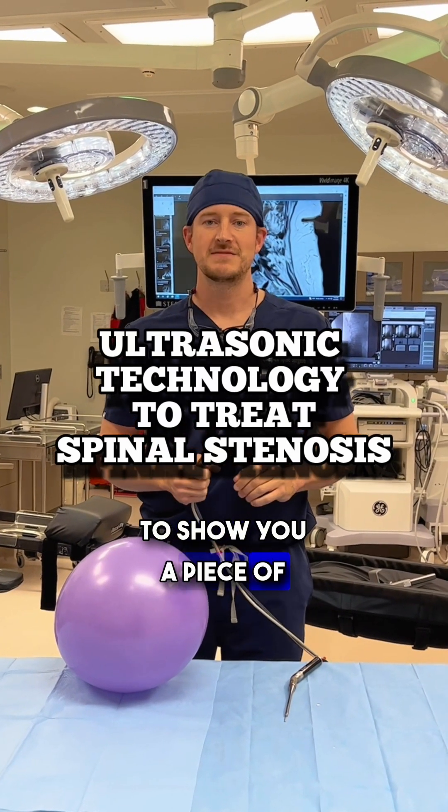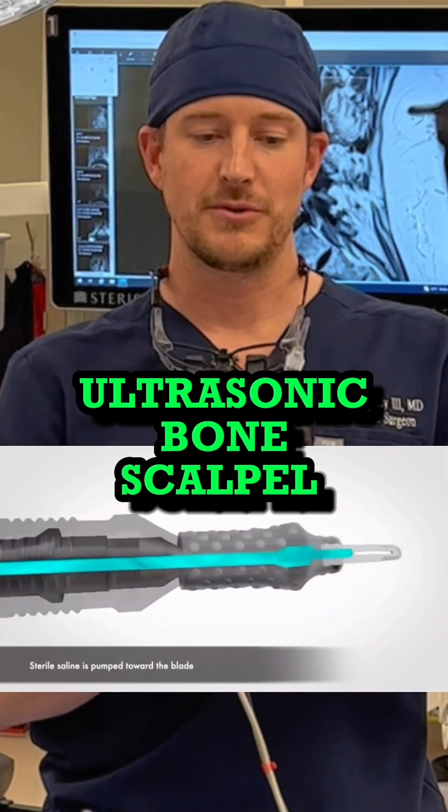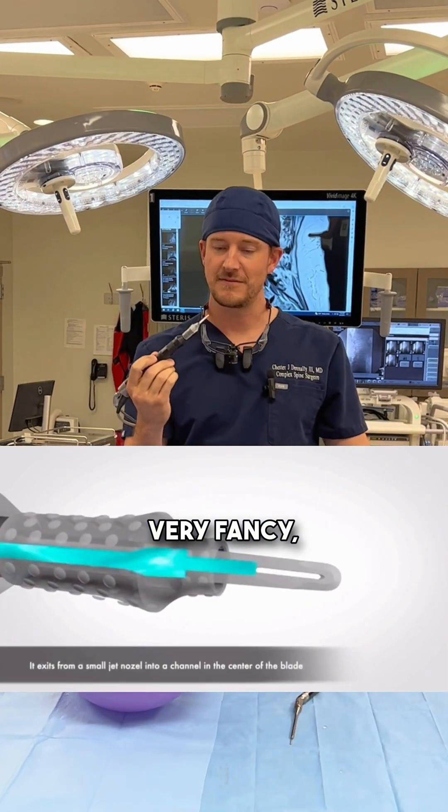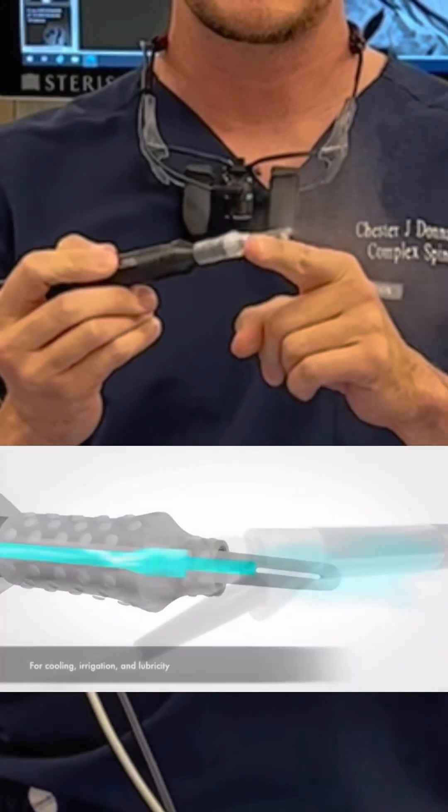Today I'm going to show you a piece of technology I'm really excited about. This is an ultrasonic bone scalpel. The thing that makes this very fancy, very high-tech, is that this blade oscillates at a high frequency, so it will not cut tissue.